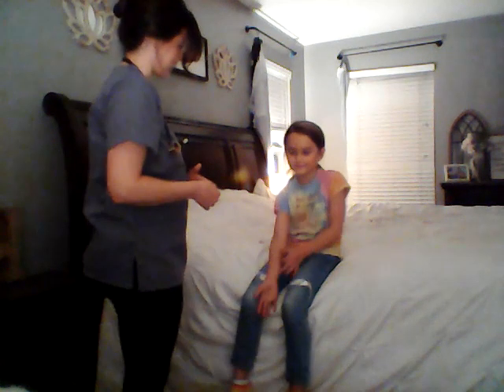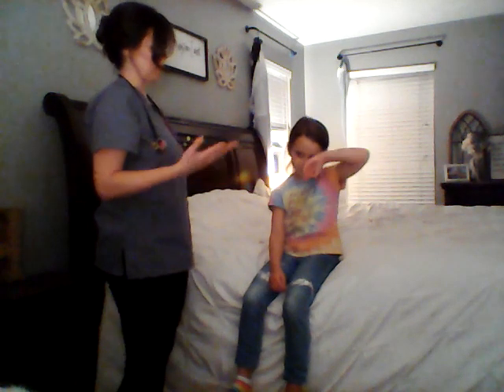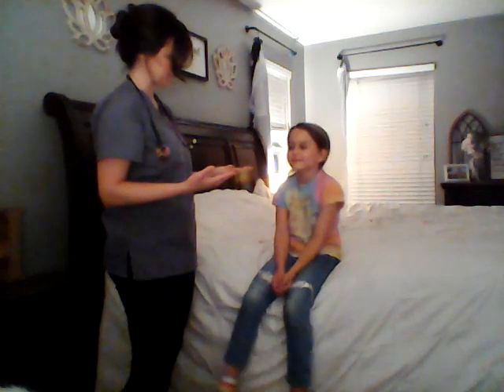Okay. And then I'm going to assess her vitals. So I'm going to take her blood pressure, her temperature. I'm going to check her pulse. And I'm also going to check her respiration rates. Do you take any medications regularly? No, okay. So now I'm going to begin the head to toe assessment.